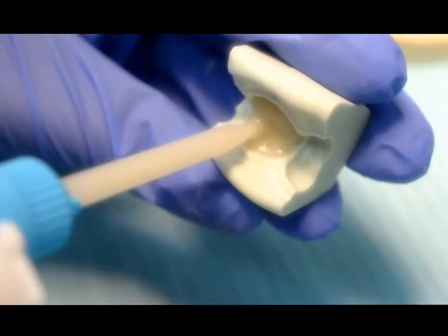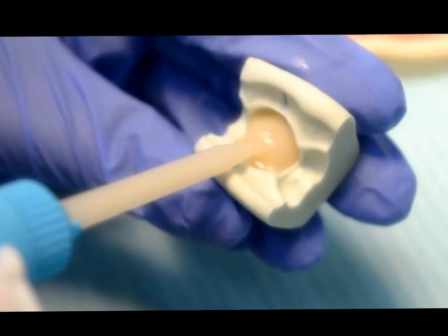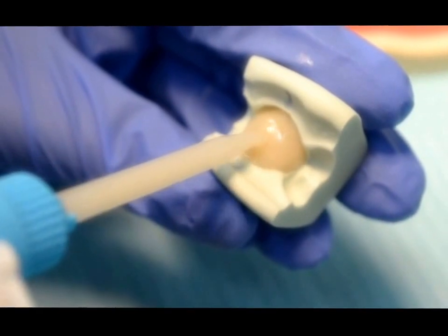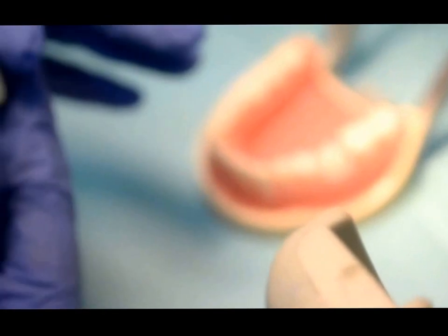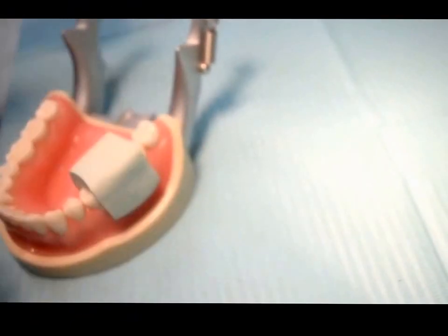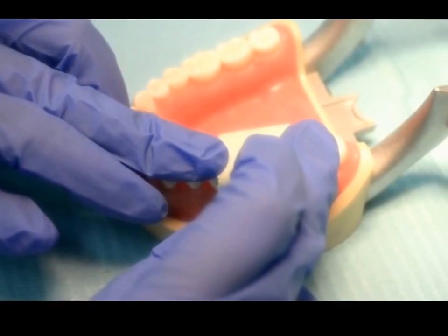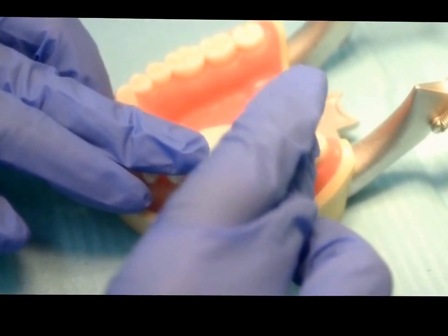You can inject the material around the margin of the tooth preparation first, and follow up by injecting into the matrix. Wait for 2 minutes to set. After it sets, you can pull it out.